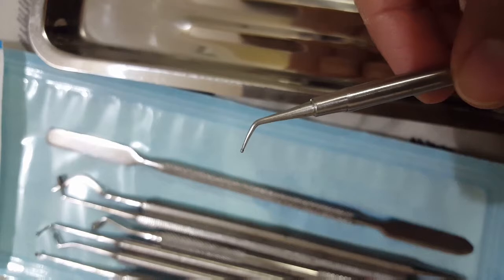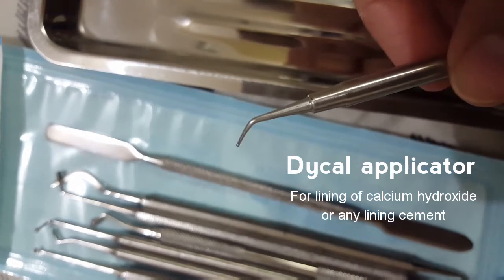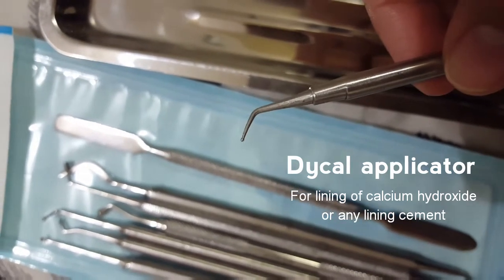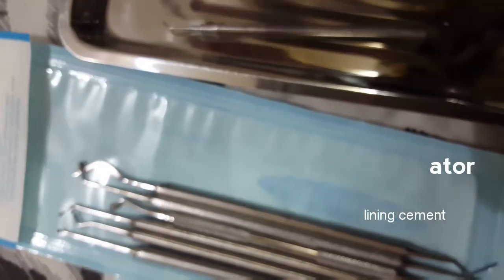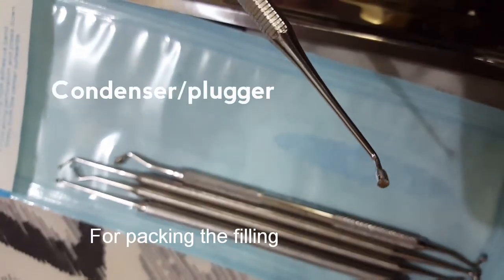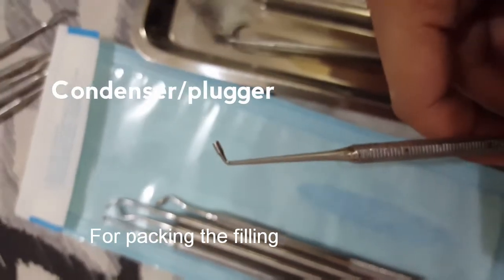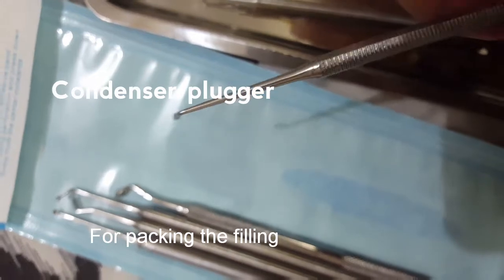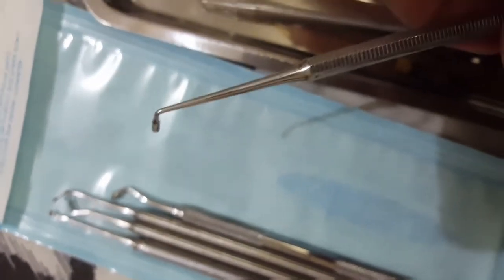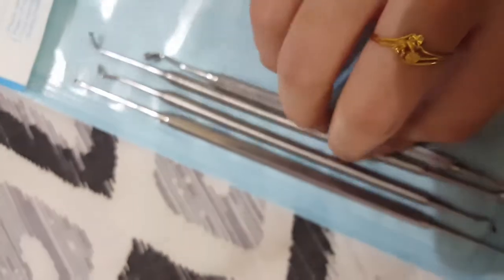This is the Dycal applicator, which is used to apply a thin layer of Dycal or calcium hydroxide as a cavity lining after you have made the cavity. This is a condenser. It is also known as a plugger. Both are the same terms used for this instrument, and it is used to condense or press down the composite after keeping a pellet of composite into the cavity. You just press down with it so it fits into the cavity shape. That's why it's called a condenser.